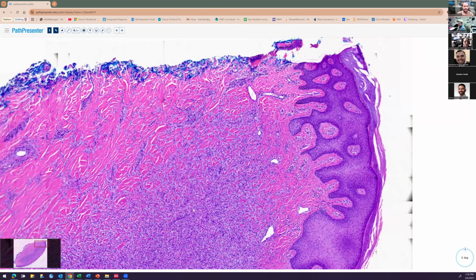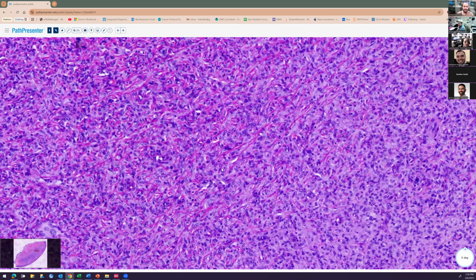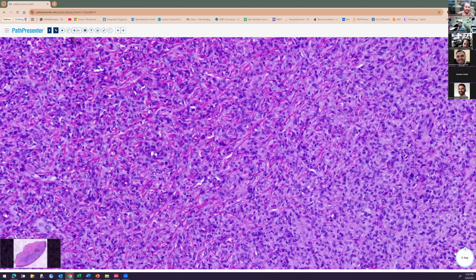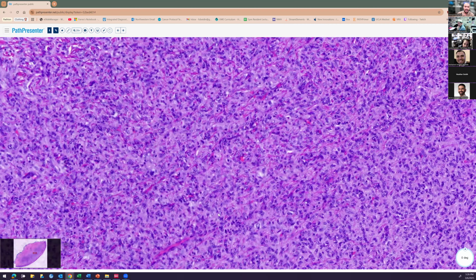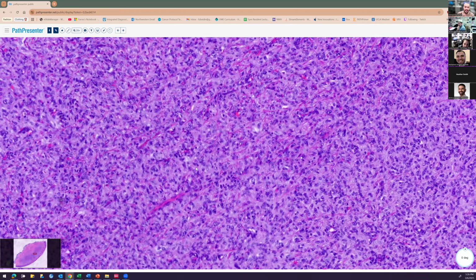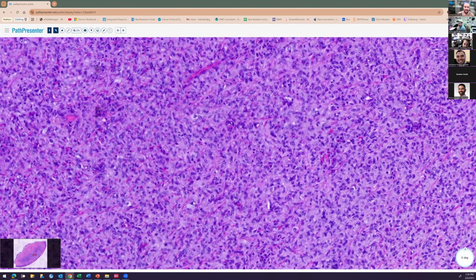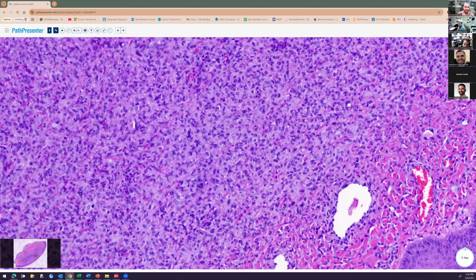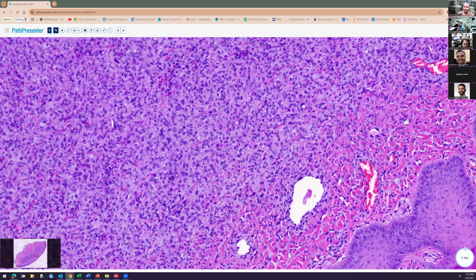Okay. All right, and let's talk about the cytology here. Yeah, it looks like a histiocytic lesion. And the reason I say this is because they have these kind of elongated nuclei with this foamy, pale cytoplasm. Okay, so there's some foamy cytoplasm. That's true. And it seems to be somewhat of an admixture of cells, right? Yeah. So you have more histiocytoid cells, and some scattered spindle cells throughout as well.